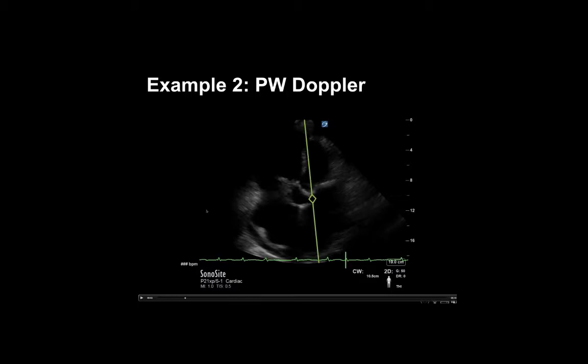So in order to engage the spectral Doppler mode, the user presses the Doppler key, not the color key now, but the Doppler key. And many of you have probably accidentally done this at times and brought up the pulse or continuous wave sampling lines and not known entirely what to do with them. But now you will. So here the person pressed Doppler. They brought up this sampling line, which you might recognize is not the pulse wave Doppler line. It is the continuous wave with the diamond shape.